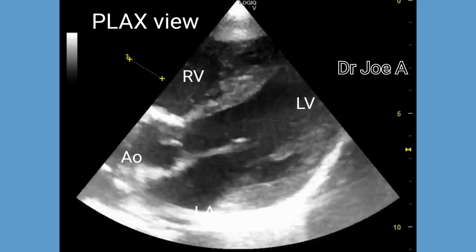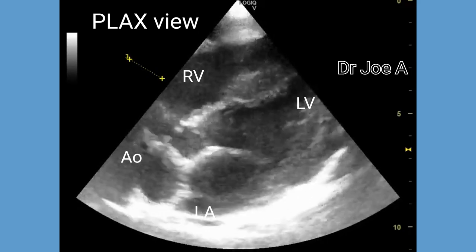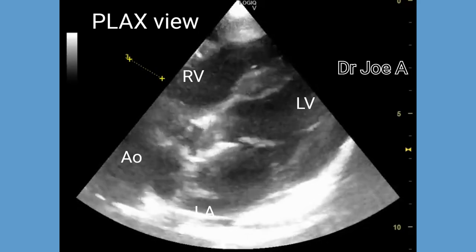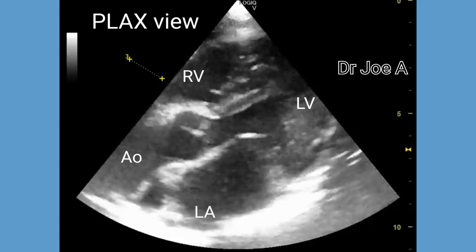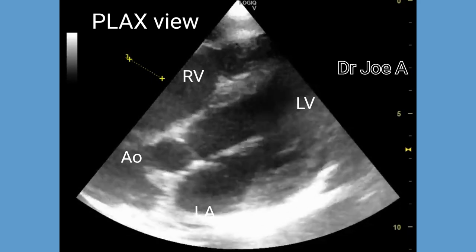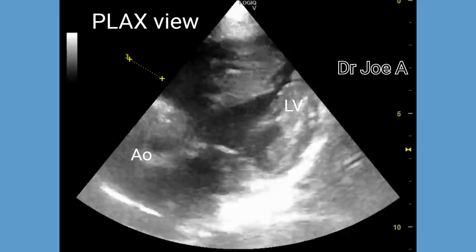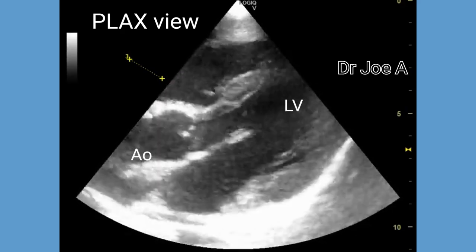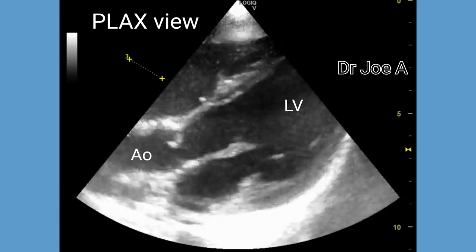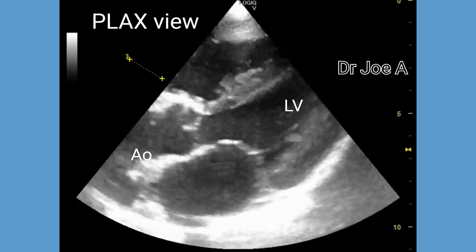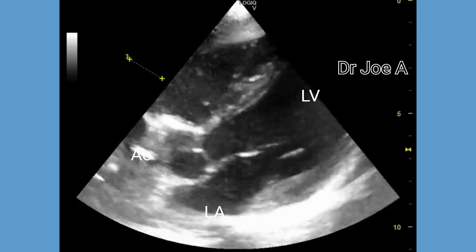Next, we go to the parasternal long-axis view, or PLAX view, to study the left ventricle and the inlet into the left ventricle from the left atrium, and also the outlet from the left ventricle into the aorta. A portion of the right ventricle is also visualized. The parasternal long-axis view is an excellent view to study the mitral and the aortic valves. In this case, both the aortic and the mitral valves appear absolutely normal.